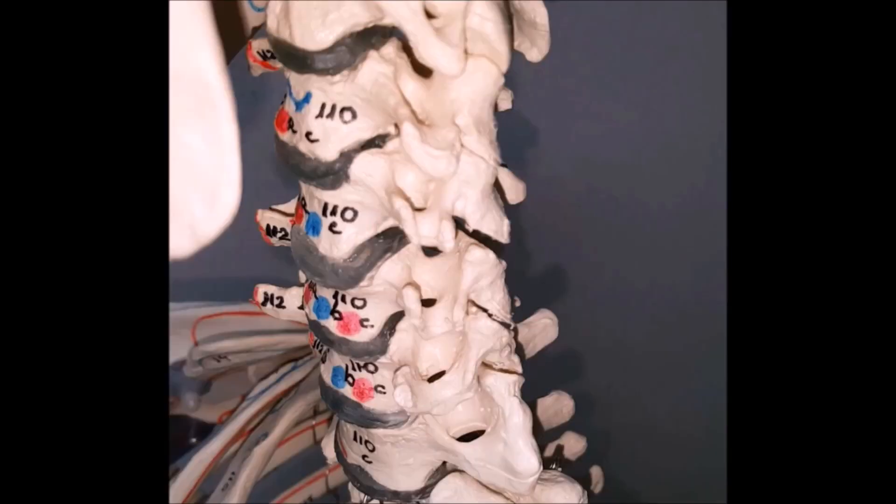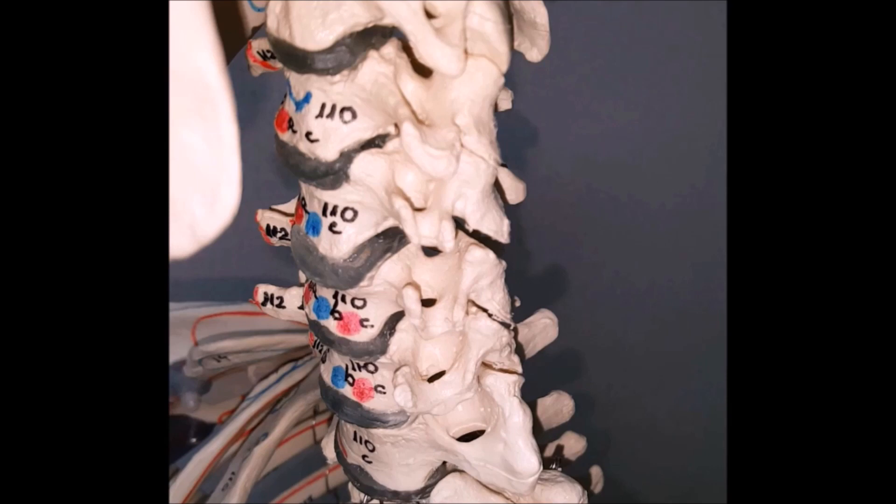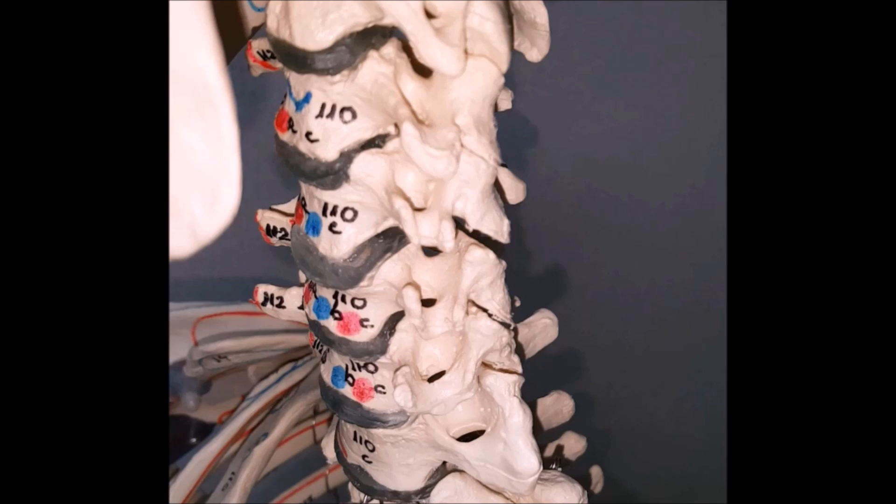Before describing how ultrasound-guided cervical spine selective nerve root block is performed, it is important that we know the crucial anatomical structures of the cervical spine.